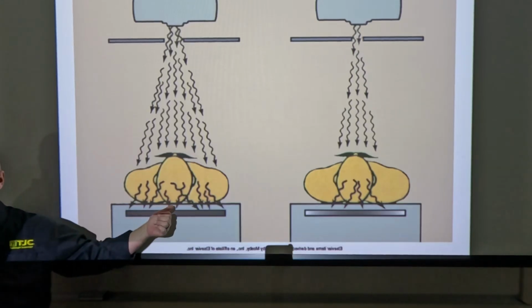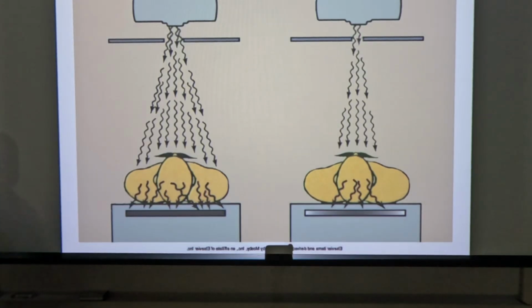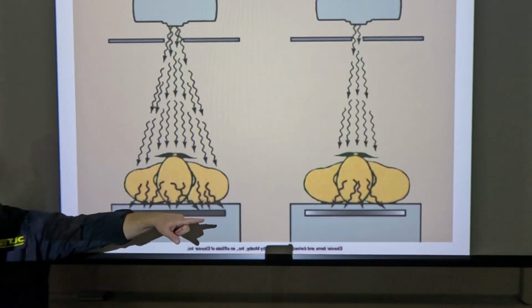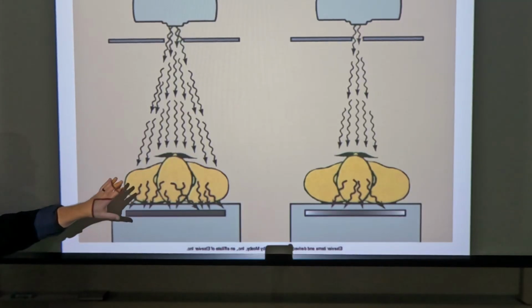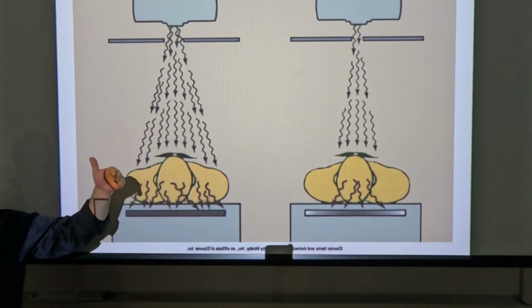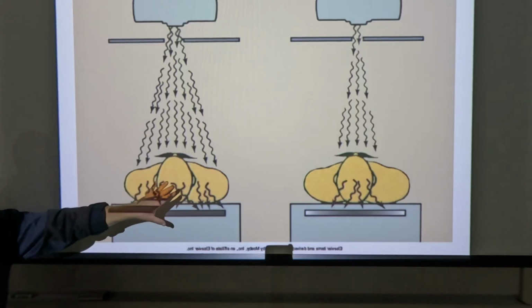Blasting every chest x-ray, or every T-spine like a chest x-ray, is that keeping your dose as low as reasonably achievable? No? What are you training to be? Radiologic technologist. What is that? Two things really: imaging specialist, but also a patient care advocate. Which one of these two is better patient care? Right, collimation. So, can't stress it enough, if your hospital or doctor protocol is to take a chest x-ray for a T-spine, and it really should be in a trauma situation, then this is what you're gonna do, okay? That's not on you, all right?